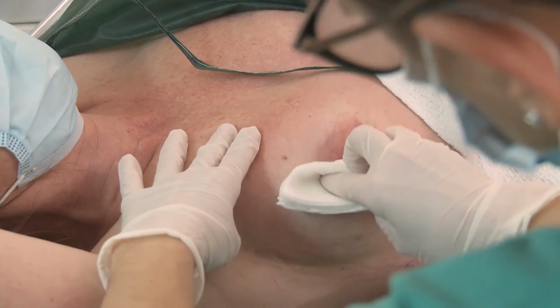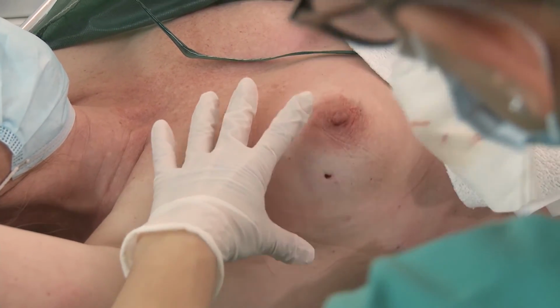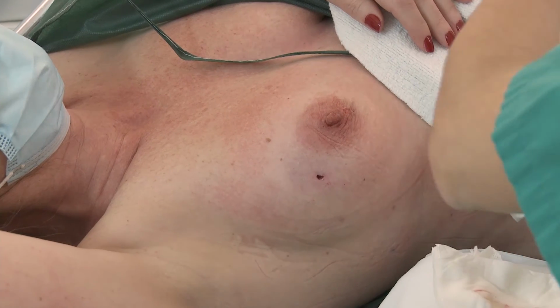When bleeding stops, the breast is cleaned and wound closure strips are attached.